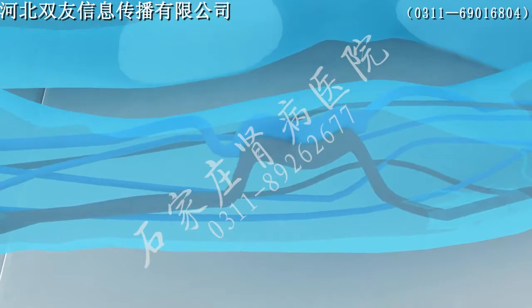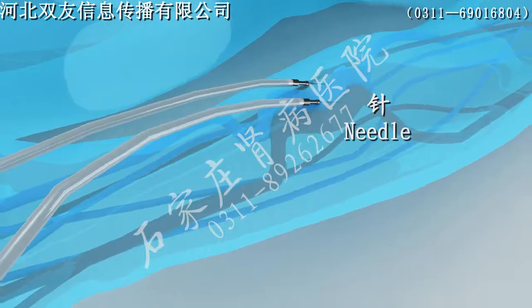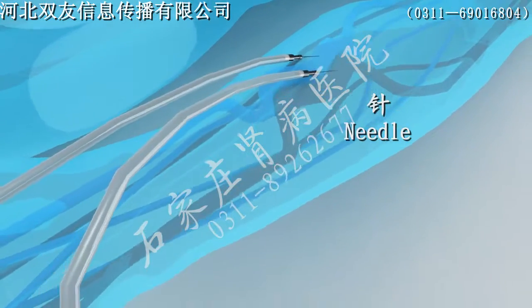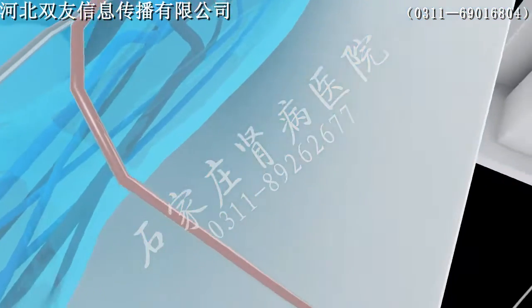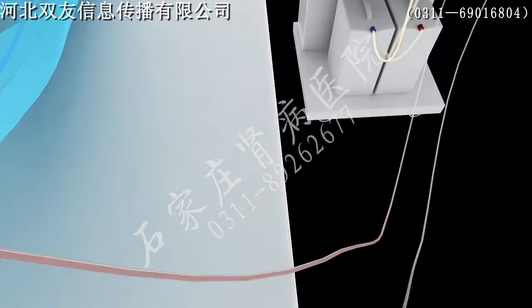Step 3. Making a vein and artery internal fistula puncture, with blood outputting from the arterial end to the machine.